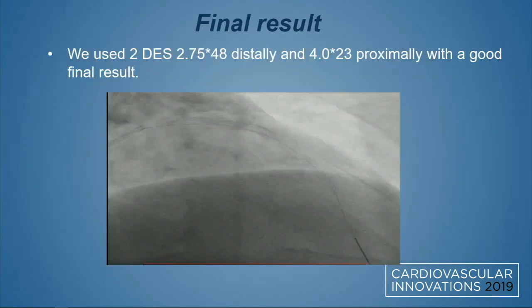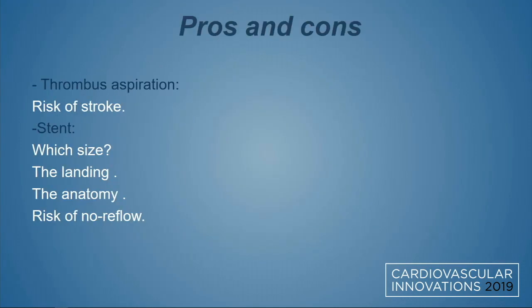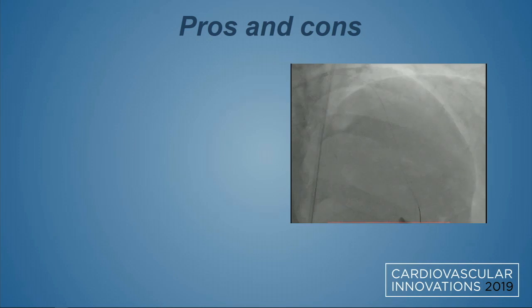Go back. Yeah, this one. The dilatation here is vague. You don't know if you are in the true or false lumen. My initial reaction was that that was an extravasation of contrast. Yes, that was my initial impression. We thought this one is a perforation.